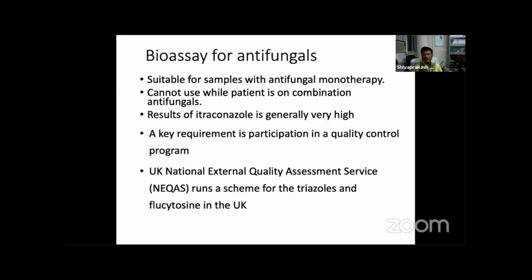So this is the main drawback of bioassay. But if the patient is on monotherapy with an antifungal, then definitely it can be useful. Regarding combinations of antifungals, I already told you that a combination will not be useful, but still, in one paper they used Candida parapsilosis, which was sensitive to voriconazole but resistant to caspofungin. So the patients were on a combination.